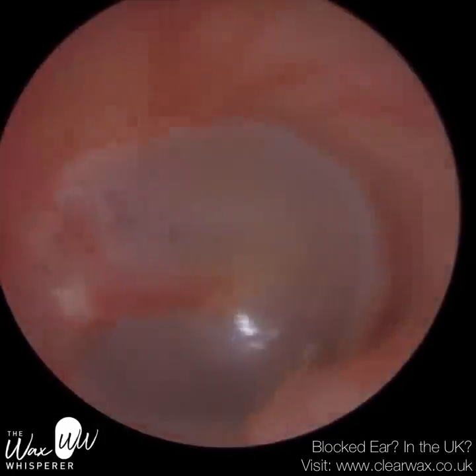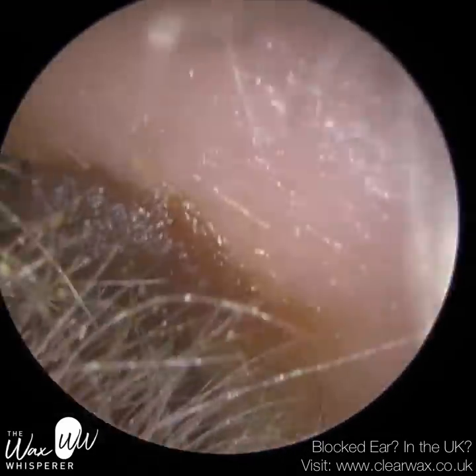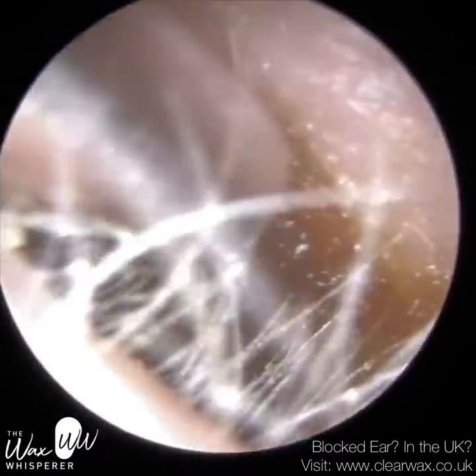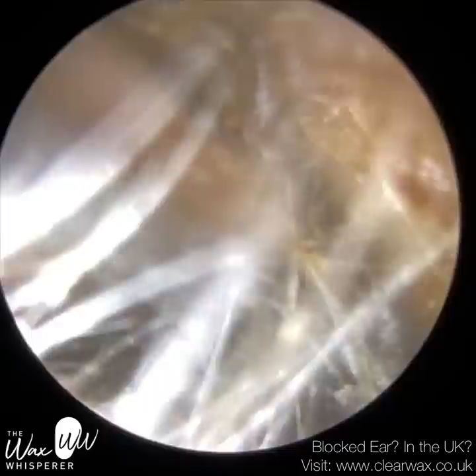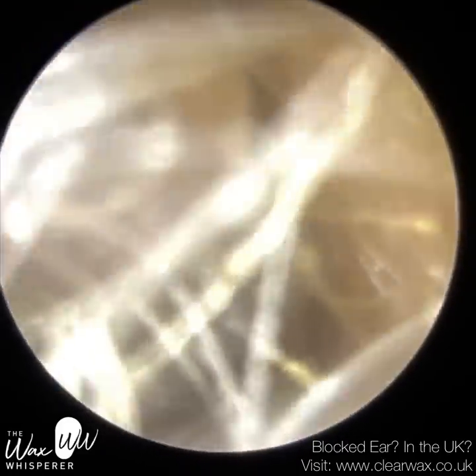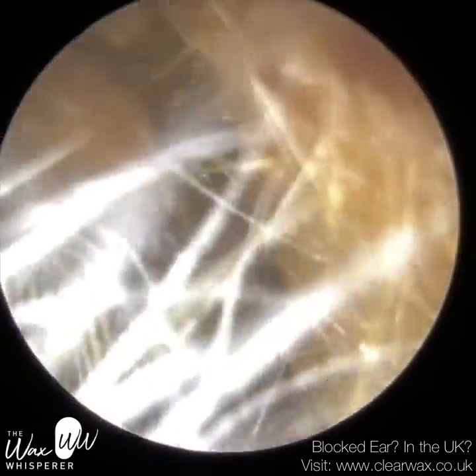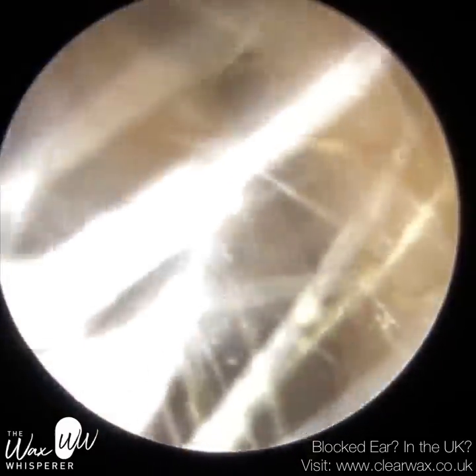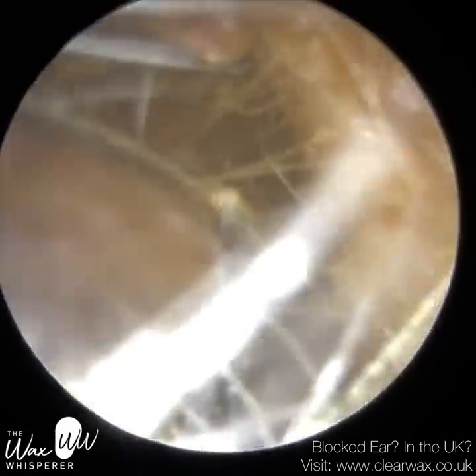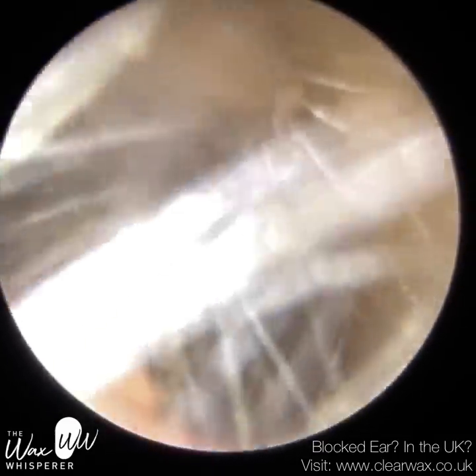You can see that little bump on the road just there at the bottom of the ear canal. This is the right ear, so this is a lot more complex. They also had a lot more hairs at the entrance of the ear canal — both sides have a lot of cilia at the entrance. These hairs should only be on the outer third of the ear canal, the cartilaginous portion. They help to filtrate the air, preventing dust, pollen, and foreign particles from entering and colonizing within the ear canal.